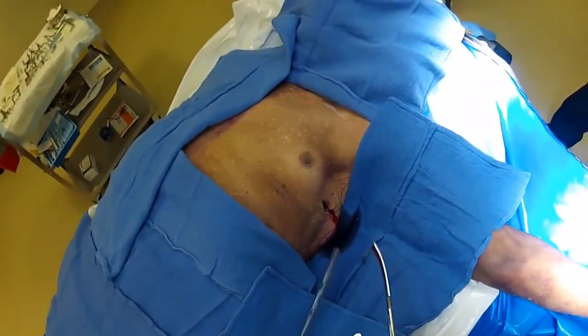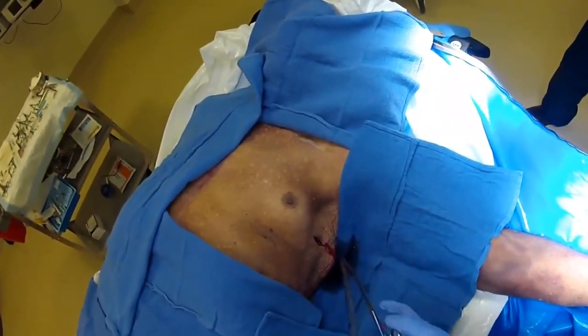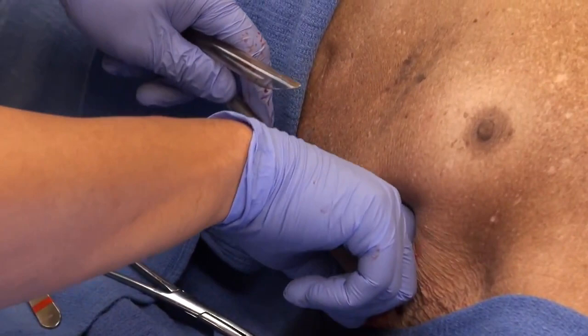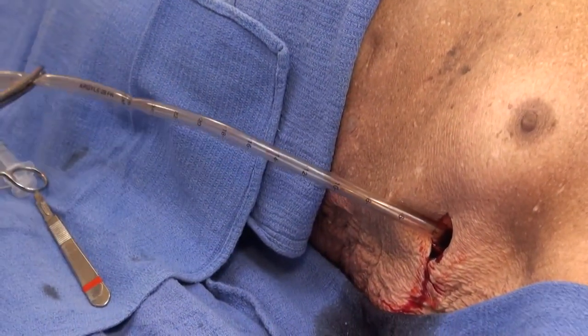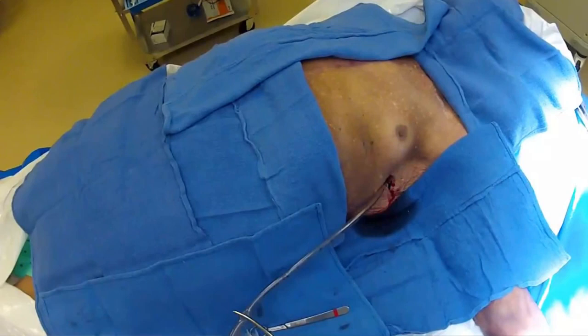The chest tube is grasped distally with a clamp, and the proximal end is either clamped or folded upon itself in the operating surgeon's hand. The chest tube should be guided into the pleural cavity, aiming posteriorly and cephalad as the clamp is released and withdrawn. The tube is advanced in a twisting fashion toward the apex of the lung. The tube should be inserted to a distance of approximately 8 to 16 centimeters, depending on patient size and body habitus.